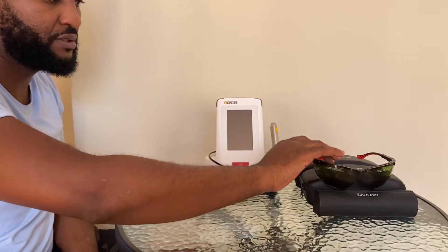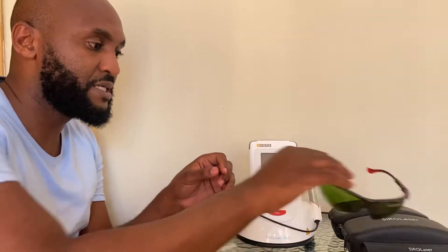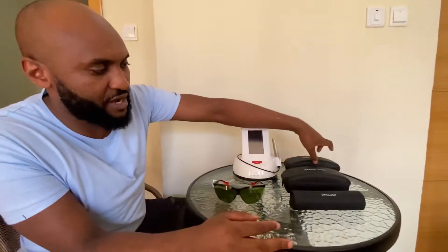A few things must be highlighted. As we have seen in the text, lasers can be dangerous to your eyes. They can also be a danger to the tissues of the patient — they are a danger to your eyes, those of your assistant, and your patient. That means at the start, we need to have three sets of special glasses, protective eyewear.